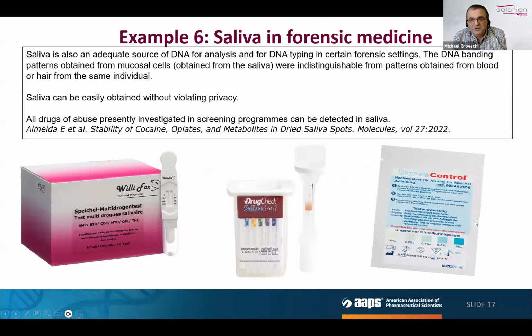The detection of narcotics, of drugs of abuse from saliva has found its way into forensics, forensic medicine and law enforcement, and this surprisingly quickly. As a rapid alternative to the previously common urine test, which understandably poses certain challenges when conducted on the roadside, the detection of opiates, cocaine, and other drugs of abuse from saliva is meanwhile a fully established alternative.